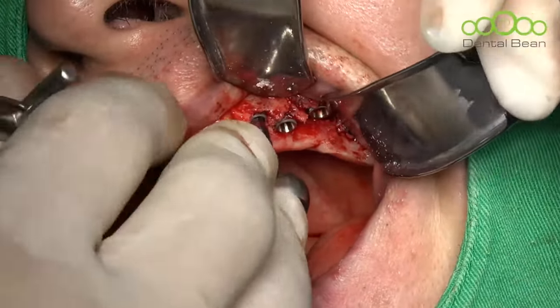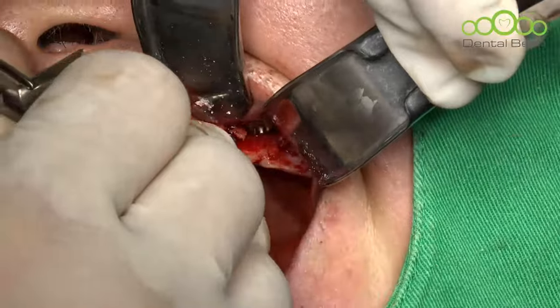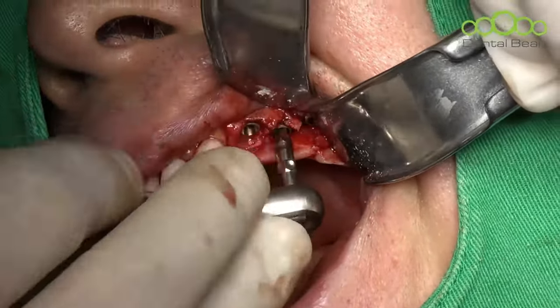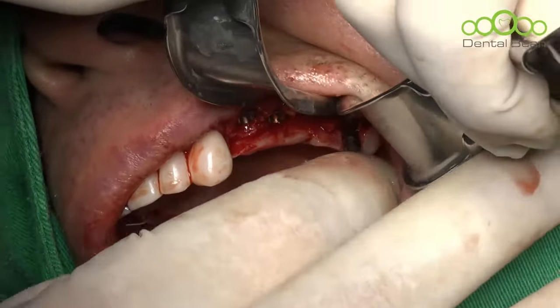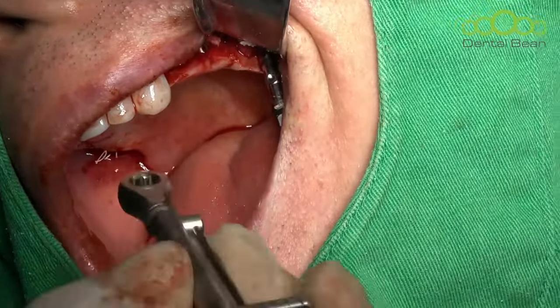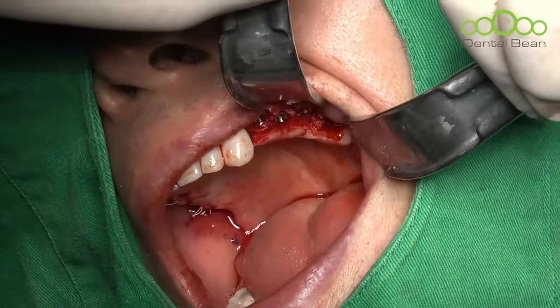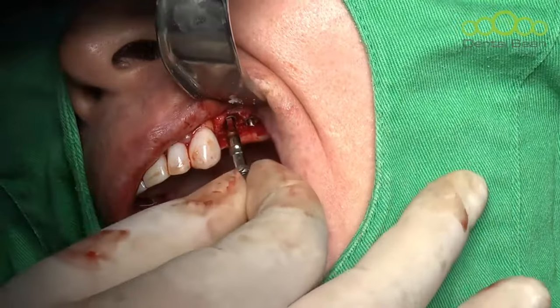One Korean dentist asked me, sometimes after splitting, he experienced bone resorption. I think it's because too thin a buccal bone was left. That's why it happened. We recommend at least 1 millimeter of buccal bone thickness after implant installation to prevent that problem. When it looks very thin, it is better to do a bone graft. And the more important thing is that many complications come from poor indication. You must do splitting when bone width looks more than 4 millimeters. Less than 4 millimeters, sometimes after splitting it looks too thin, too narrow, and it easily resorbs.